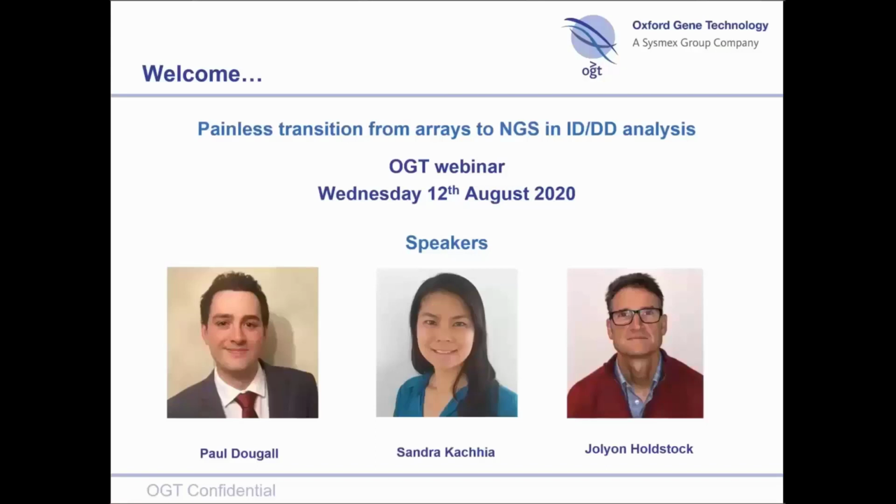So currently we have a set gene list based on, as we talked about in the presentation, we looked at different places and we curated the best gene list possible for the current information. But you're right, as more genes enter into the system, we'll have to update. But we don't predict to be doing many updates currently, so it'll probably be very few in the next couple of years because people don't like to constantly be validating their processes. So we will update if there's a great reason to, but currently there's not room to add additional genes.